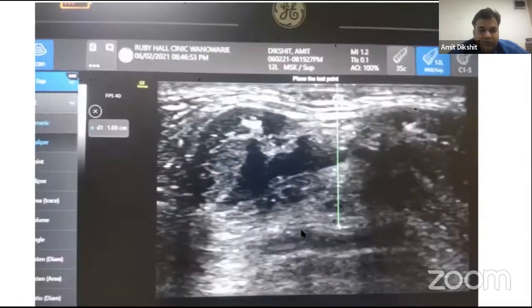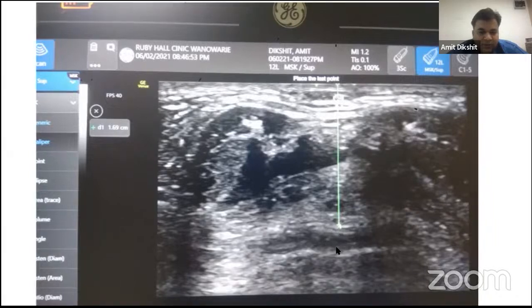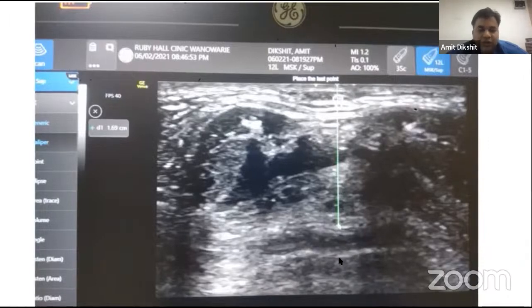And this is the black hypoechoic area. So instead of placing the cursor up to here, probably the air mucosal interface is the white line, and people say that we should be calculating from the base, like to write down there. Now most of the articles are coming up saying mid epiglottis. Even some of them, instead of using a transverse scan, are using a parasagittal scan. So more and more information.